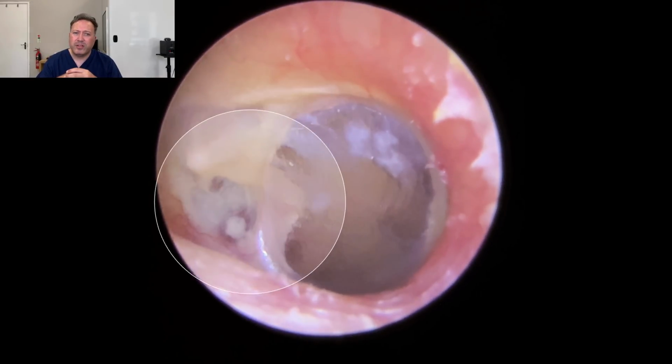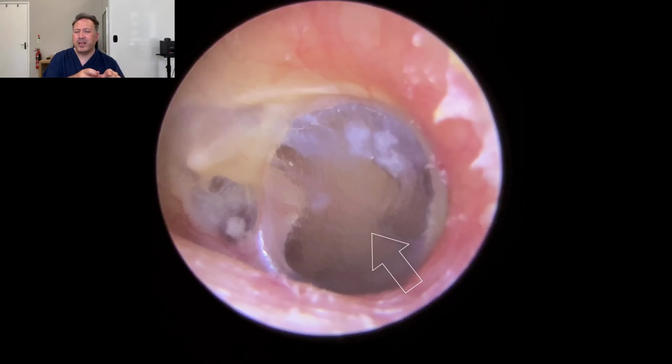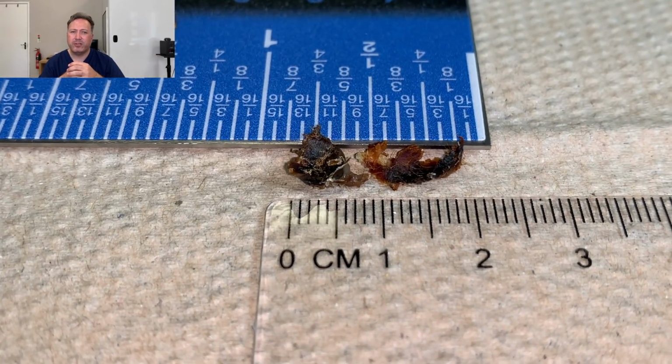So have another good look at this eardrum. So you can see there the hammer bone, you can see everything pulled quite tight around that. You can really clearly make that out there. And then you've got this section here to the right hand side where you've got that more flexible part of the eardrum, and it's drawn into the space behind. So yeah, quite retracted on that side.